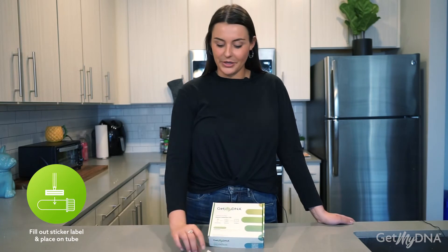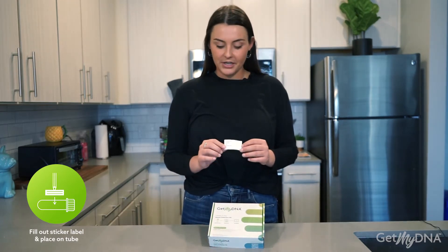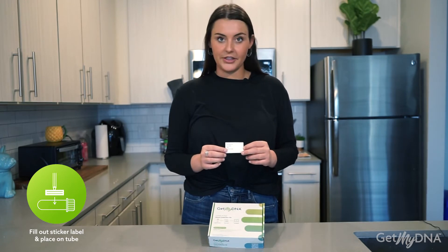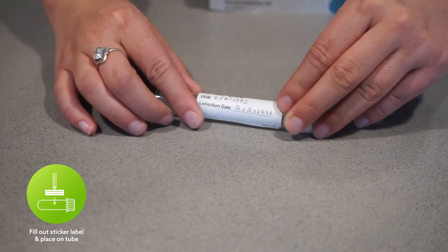Next, find the sticker label located in your box. With a pen, write legibly and in print. You will write your name, date of birth, and date of collection. Place the filled out sticker label on your tube vertically.